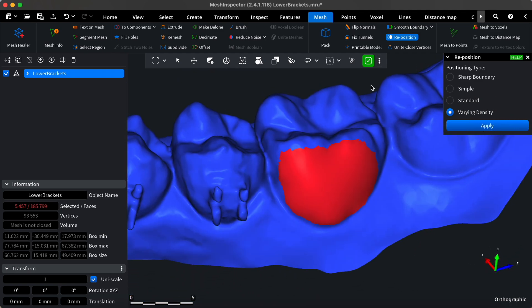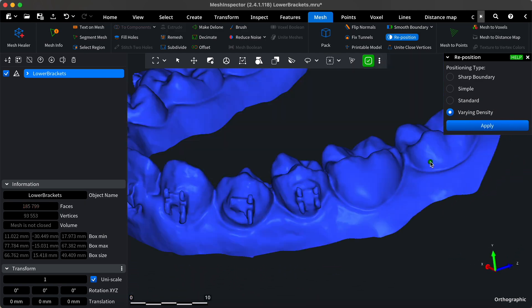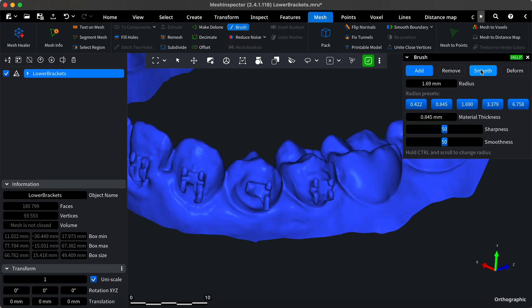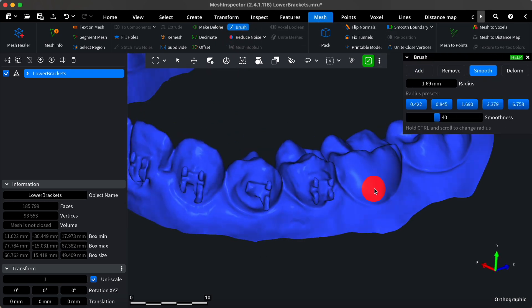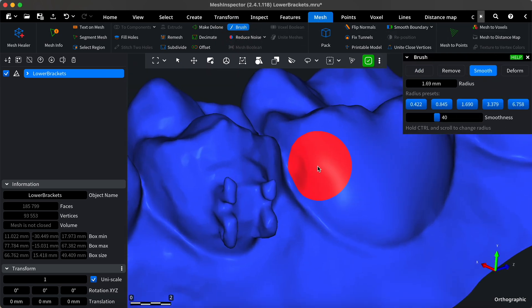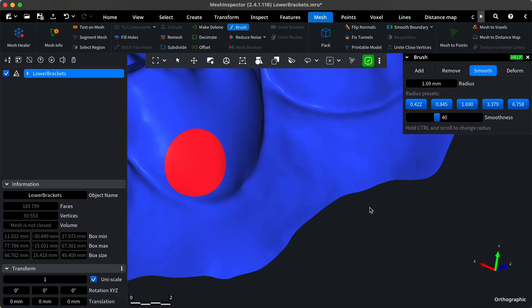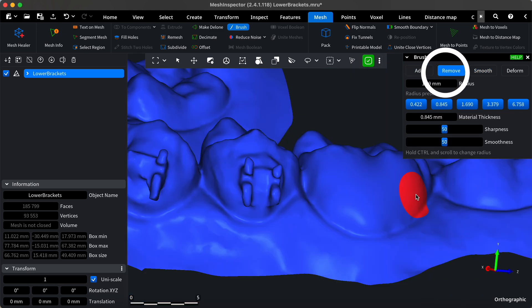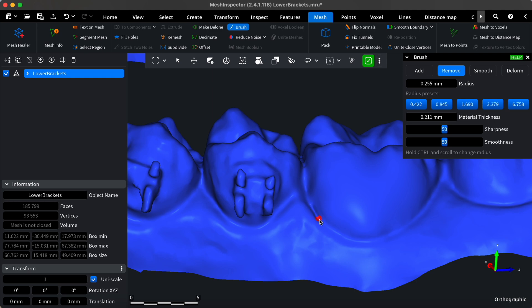If further refinement is needed, you can use the brush tool to smooth the area. This tool allows you to add or remove material and smooth specific areas. I'll gently touch the areas I want to smooth and remove to finalize this tooth.